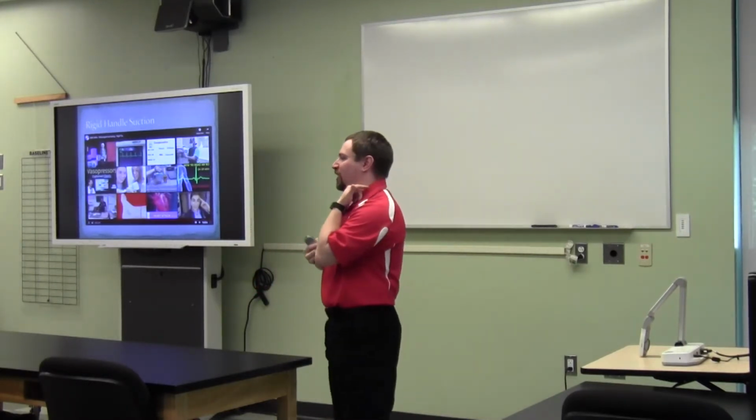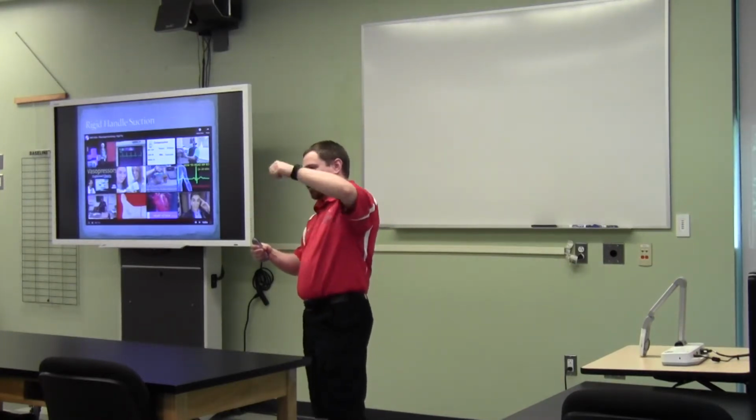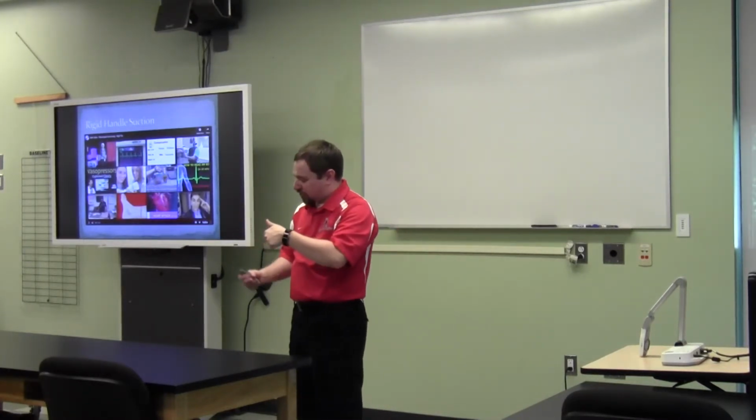It's a very similar concept. Once again, you measure from the nose to the ear. You go through. The difference there is there's a little white handle on those. You put your thumb over that. That creates the seal, creates the suctioning. And once again, you just suction on your way out.